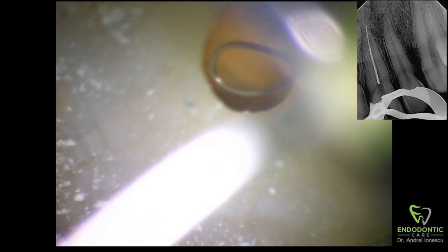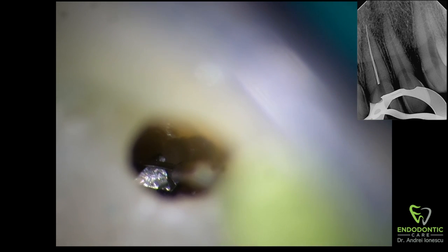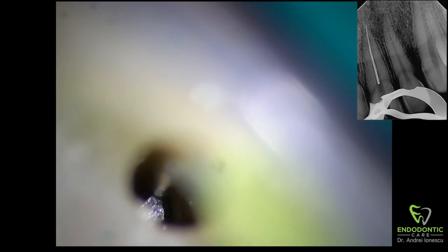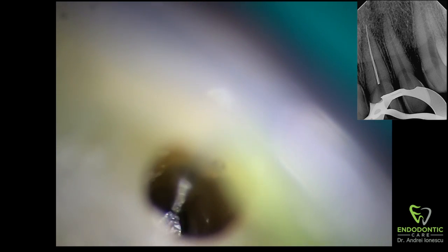There's the loop of the lasso, angled towards the palate. You can see it seated around the file, though it's actually not even fully seated. I was able to grab onto two sides of the file and you can tighten the wheel — you can actually feel it. There's a nice tactile feel; you can feel the wire getting tight around the file, so you know when you have a good grip on it.